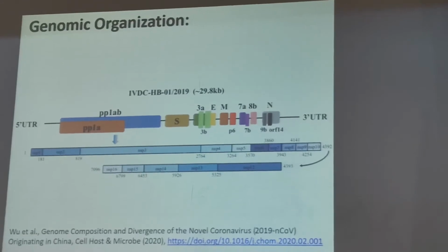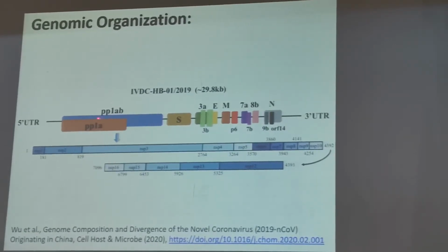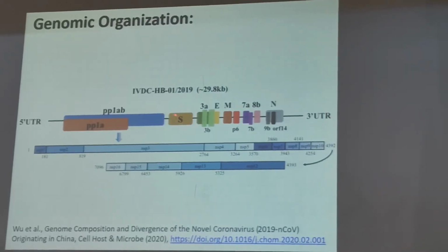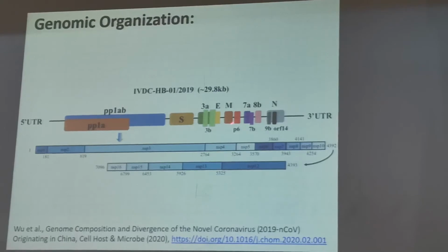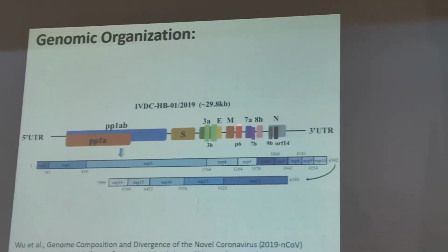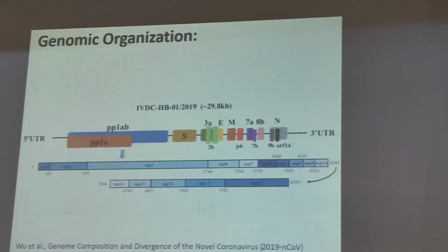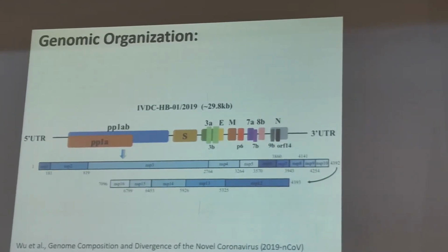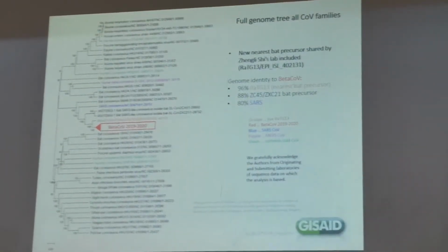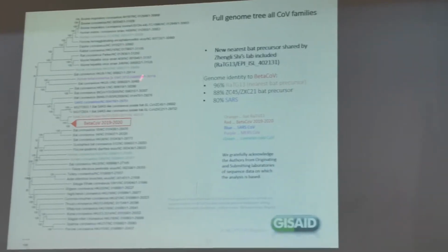region. So for molecular diagnosis, we normally target these genes, but there is some mechanism to target these kinds of specific sites on the genome of the virus in the molecular labs. So for this targeting, we should know about the phylogenetic tree of the virus.